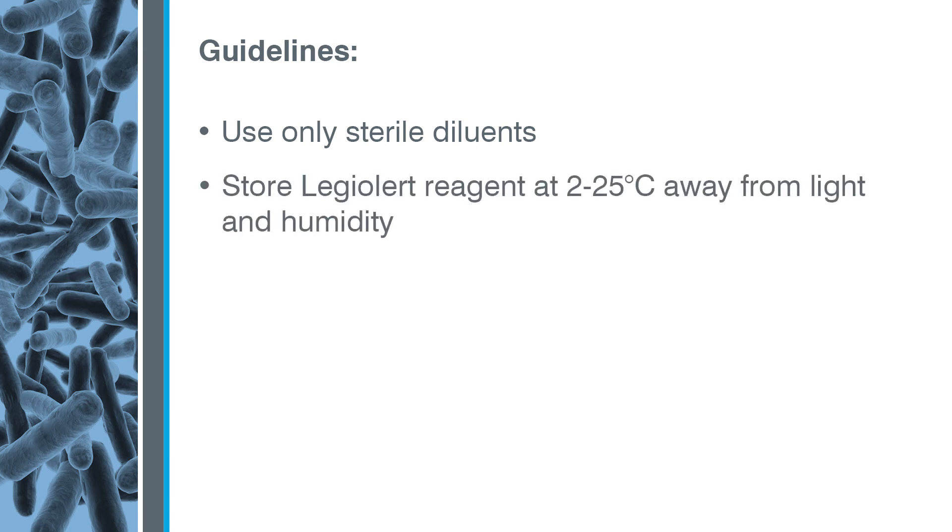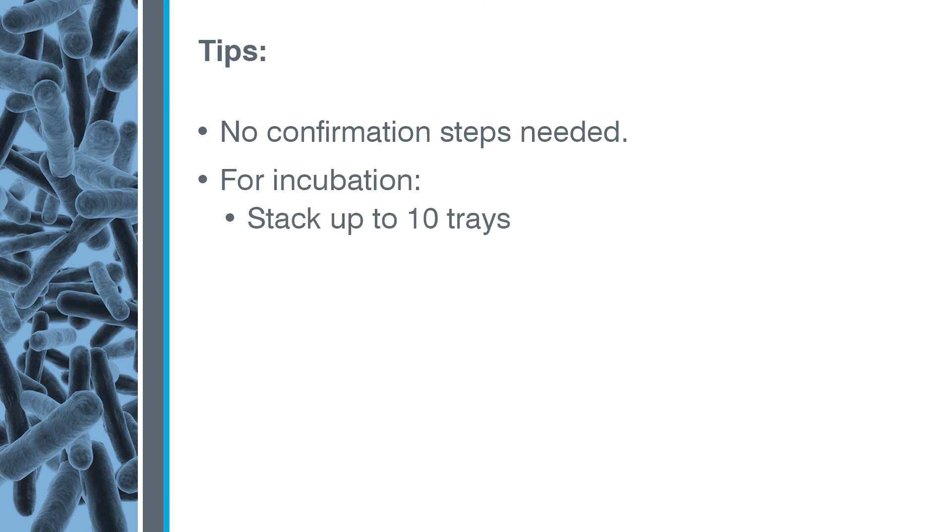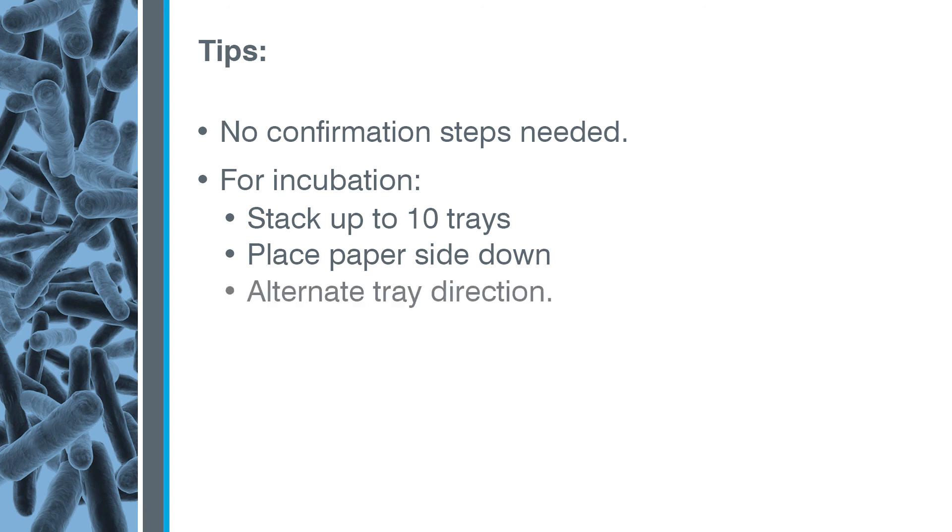Store LegiAlert reagent at 2 to 25 degrees centigrade, away from light and humidity. Always follow aseptic technique. Keep these tips in mind: no confirmation steps are needed, up to 10 trays can be stacked for incubation, always place trays paper-side down in the incubator and alternate tray direction.